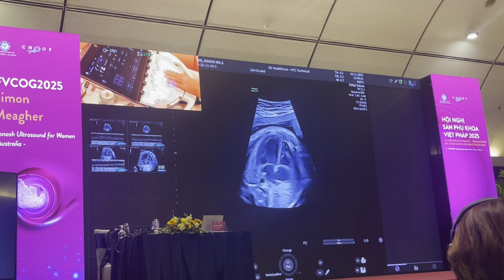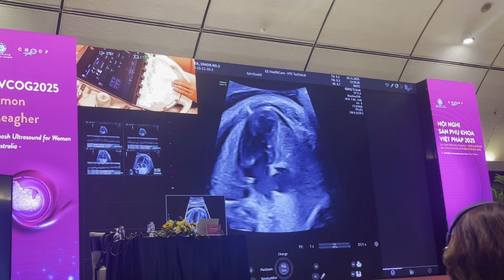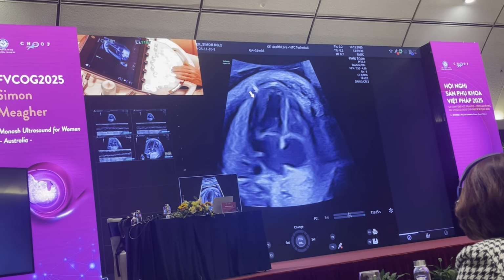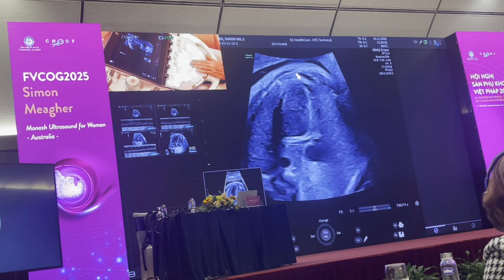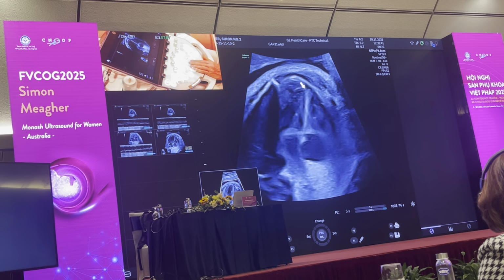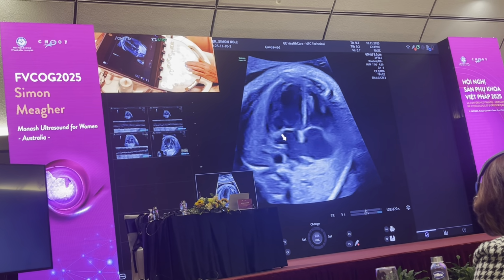And then when I'm looking at the cardiomegaly, I ask myself, is there pericardial effusion? As I look at this here, I see that this is a normal amount of fluid around the baby's heart and around the right ventricle. Most pericardial effusions occur around the right ventricle. I see that the apex of the heart is formed by the left ventricle. This is the right ventricle over here, this is the left ventricle here. The descending aorta tells me that this is the left atrium.